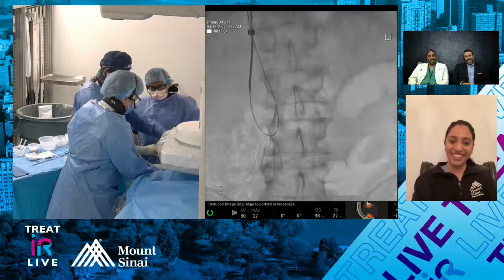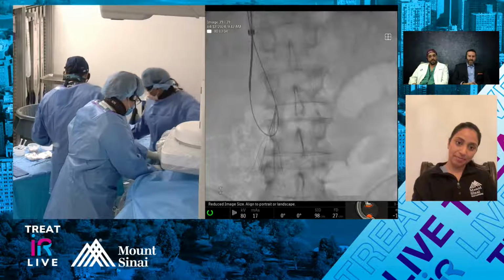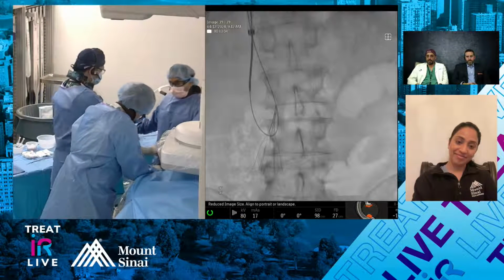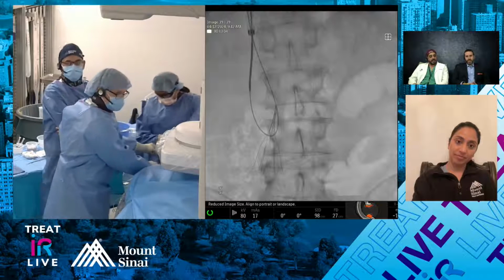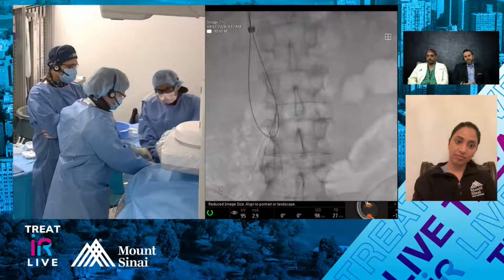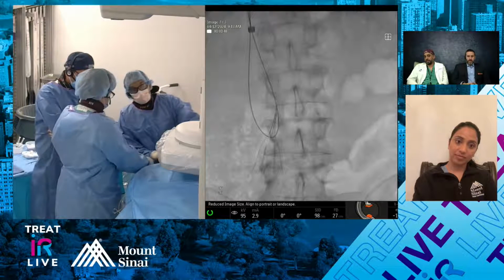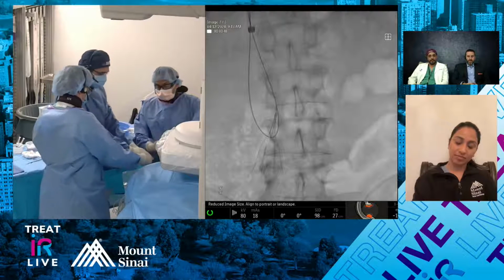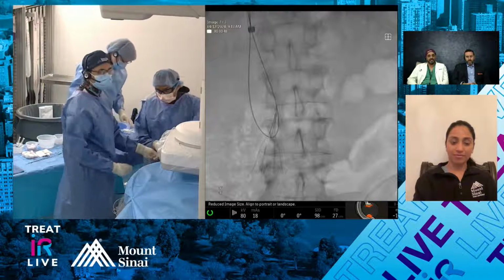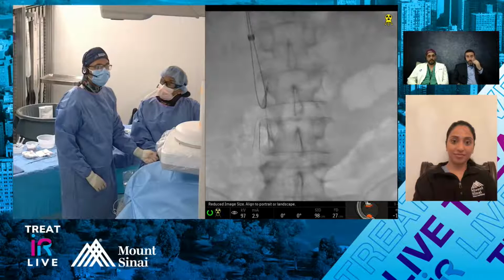Yeah, I mean, we've definitely been burned, especially because the different sheaths you have from the neck are somewhat limited. Argon does have a new dual lumen 16 French sheath, which we haven't used yet, which is a little bit more reinforced and an appropriate length for jugular work. But if you want to use forceps from the neck without that sheath, you're limited to the Cook sheath, and that sheath's not really reinforced. We've had it strip and tear and get stuck in very bad places. From the groin, it's not such a big deal because the lengths aren't as big of an issue.